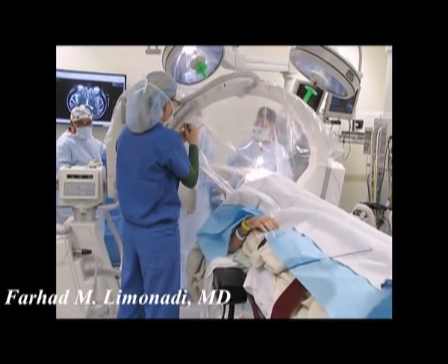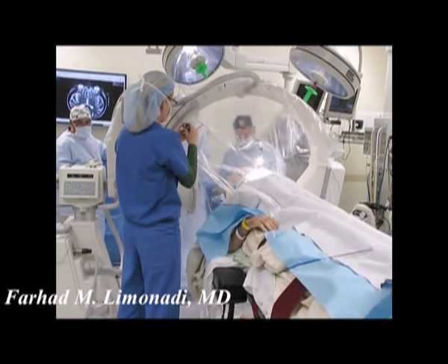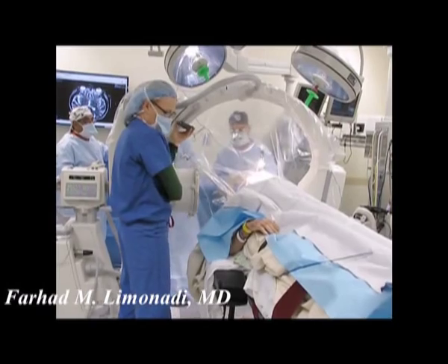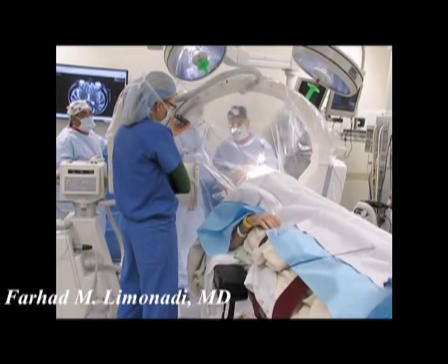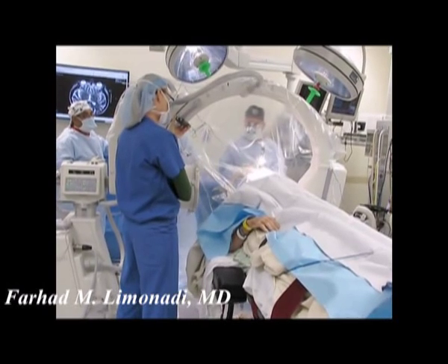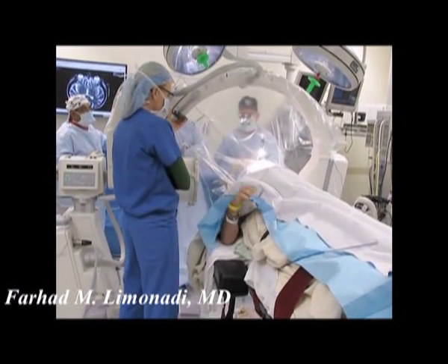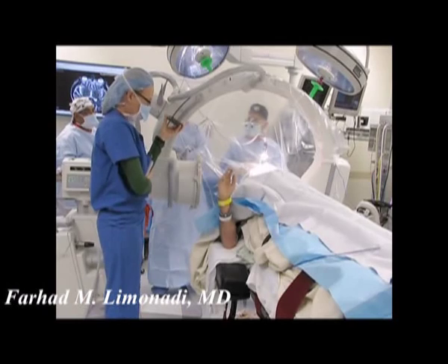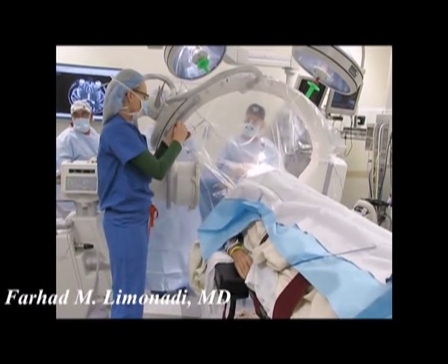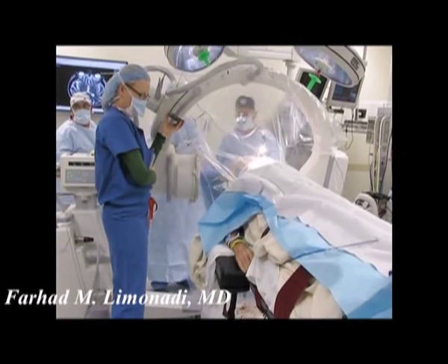0.5 volts. All right. If you feel any sensation in the corner of your mouth on the right side or your fingers, let me know. Did you feel anything? No. Okay, can you say it a little louder so we can hear you? Can you hold your arm up in the air? Good. And put it down. Did you feel anything here?